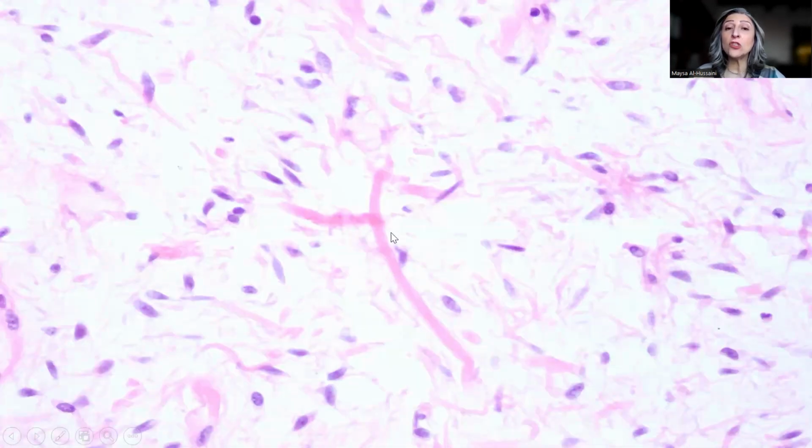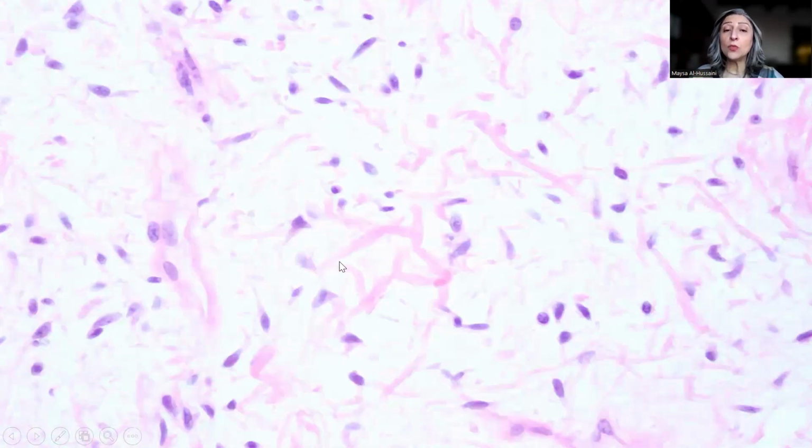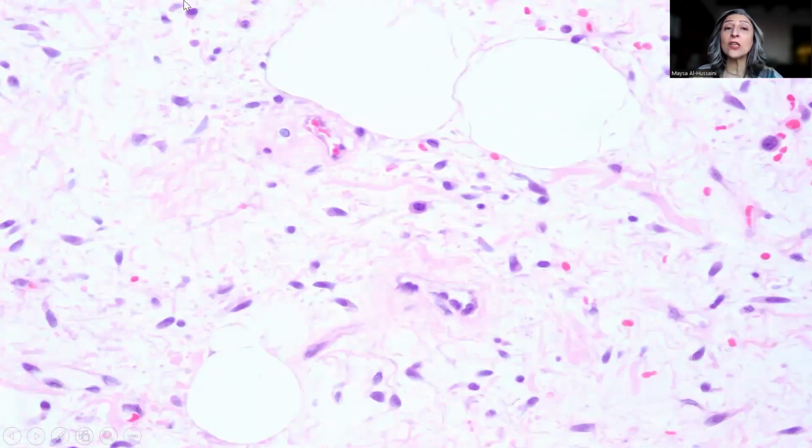And again here, just to highlight beautifully the collagen, and the collagen, by the way, is refractile. So if you try to polarize the collagen, it would show also beautifully, and more of the different shapes and sizes of the collagen, the stellate cells, the spindle-shaped cells. And this actually very beautiful field summarizes the features that we usually would like to see in the typical case of a spindle cell lipoma.